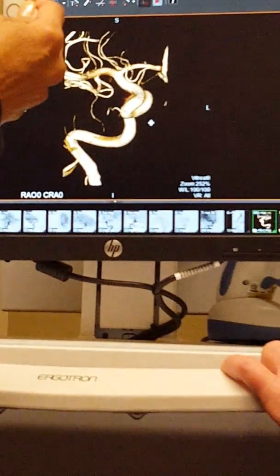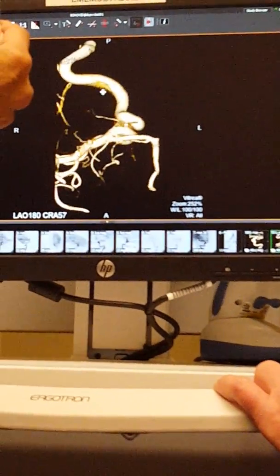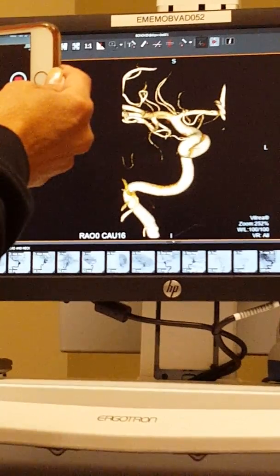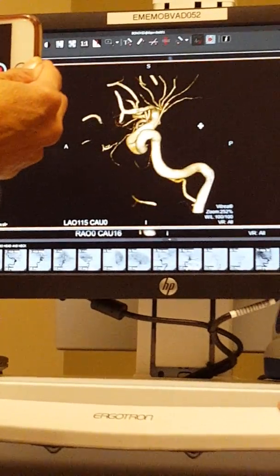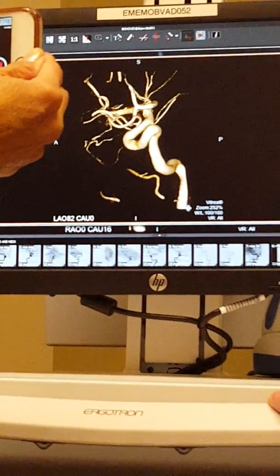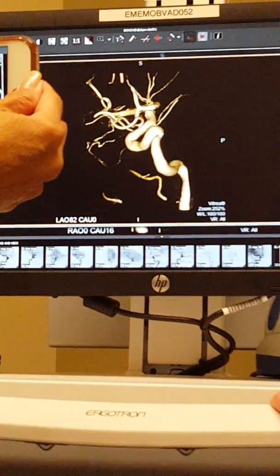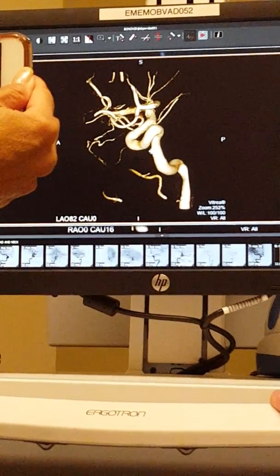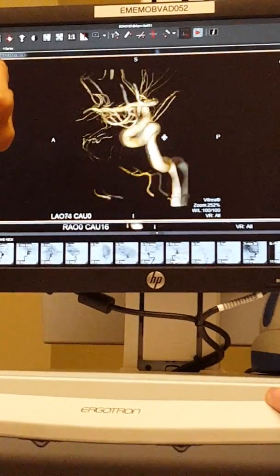So show me where it should be a C. Oh, okay. This here should look like the letter C, and your neck is down here, your artery comes up, that's totally normal, and here it just comes up higher than it normally does in a lot of people, just the way you were born. So you have more of an S configuration. Okay.